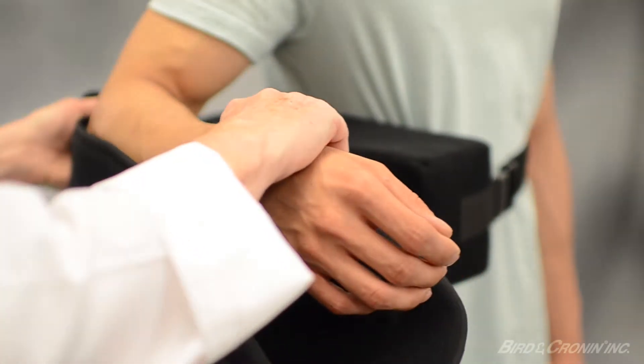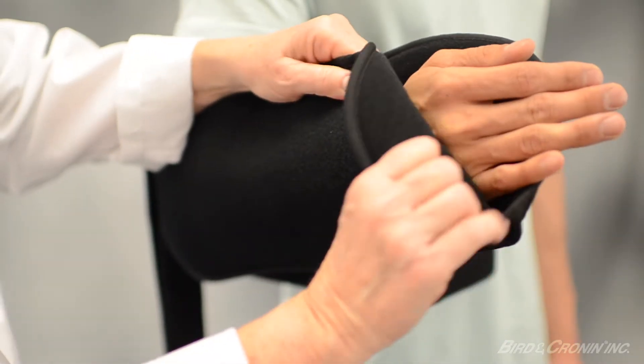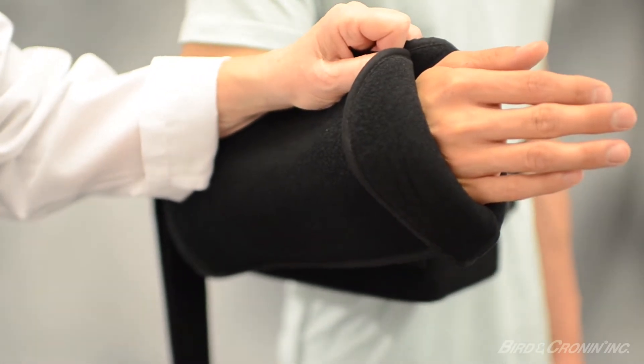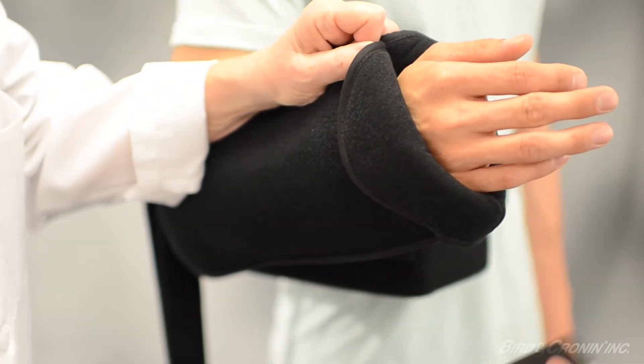To properly size the sling, place the patient's affected arm into the sling pouch. Fold back to the correct length, which should just cover the knuckles. Using the two 1.5 inch hook tabs, press and secure the folded material.